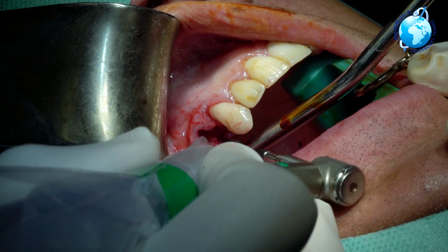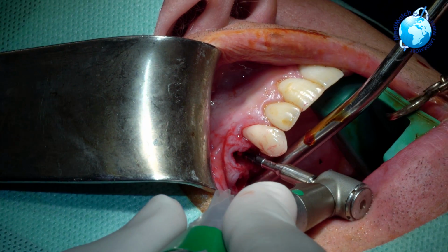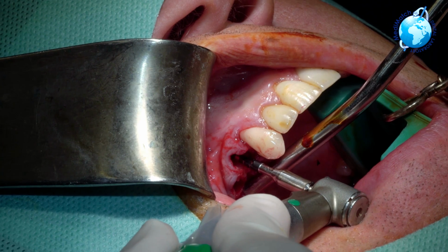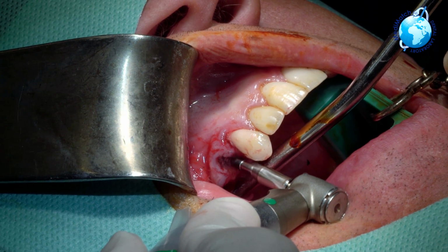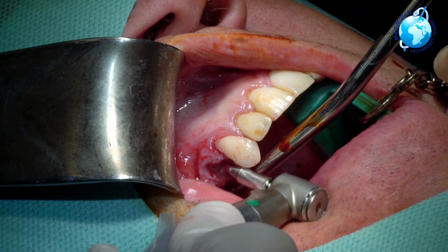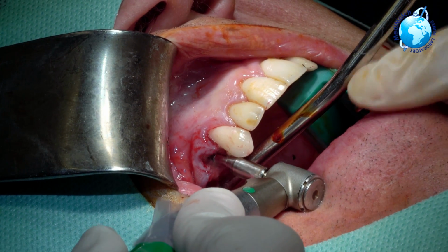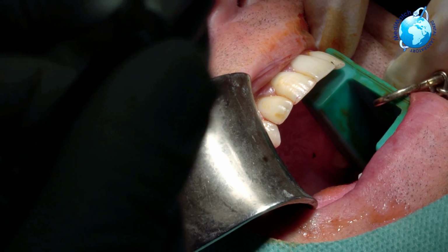I'm going to look in there. A little bit wider, Alan. Cheers, buddy. Just going a little bit distal from that root, a bit distal. And I'm going to sink it down to where we need it. Open, Alan. Thank you. That's awesome, so that's getting into the right direction.